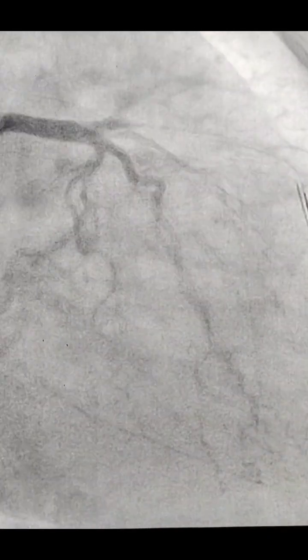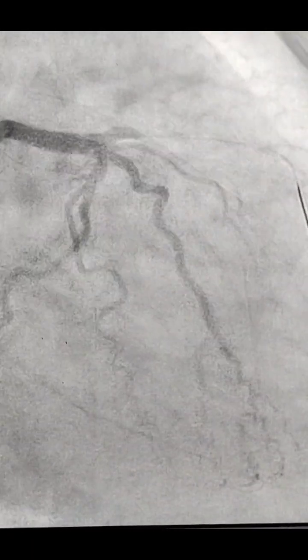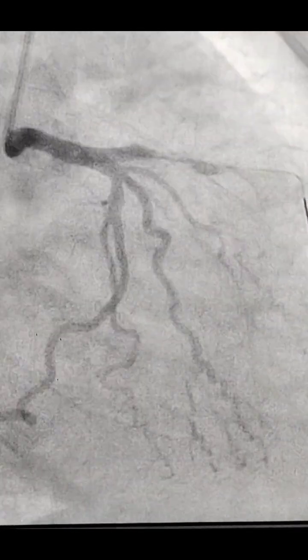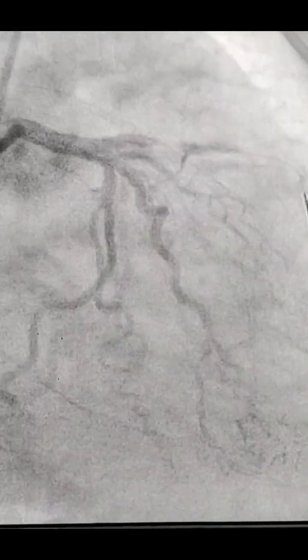So the thing is, such an ostial LAD lesion, if we predilate before stent, then there's a chance of this thrombus migrating to the LM, and can cause the LCX to get blocked and then other consequences. So generally I avoid doing a predilatation. In rare cases I do the predilatation, if it is not near the ostium. If I can see the length of the stent and everything, then generally I don't do the predilatation, and if it is not even calcified, it's only pure thrombus.